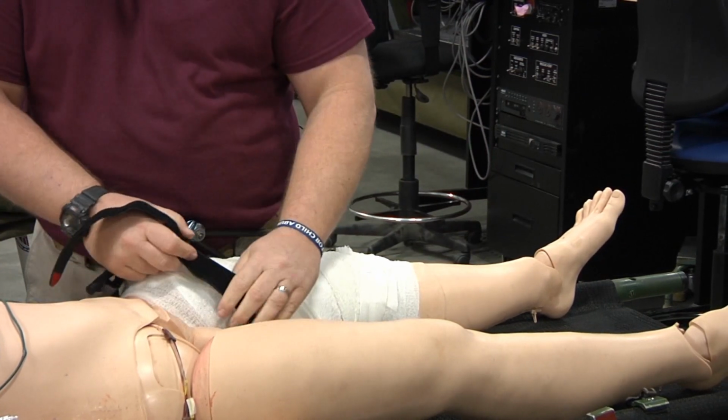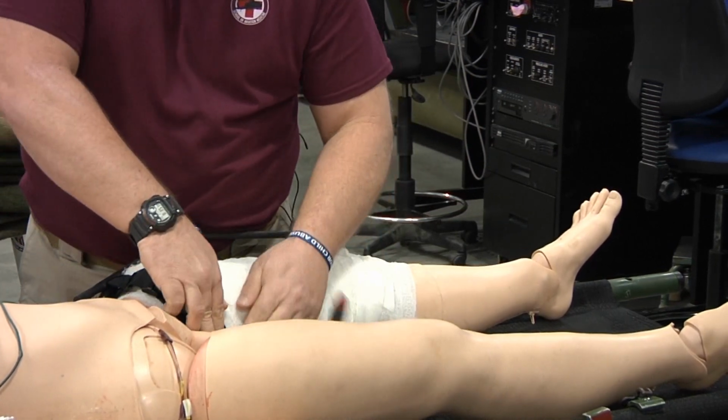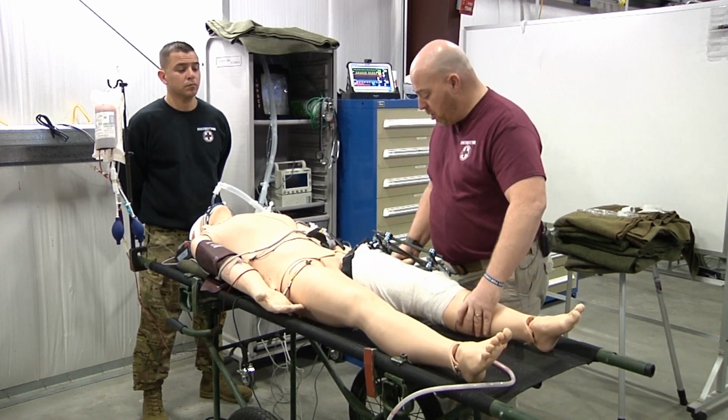And again, you're not tightening them down. You're just getting them snug. So then in the event the patient starts to bleed again in flight, all you have to do is secure that tourniquet.